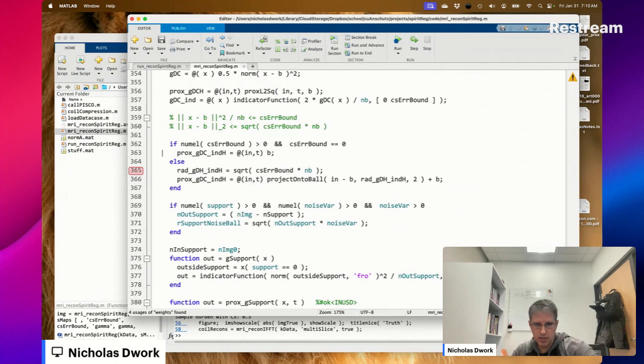What does that leave us with? We have a metric for the error of the norm, or for the error in the sensitivity maps. You know how much the sensitivity maps might differ?